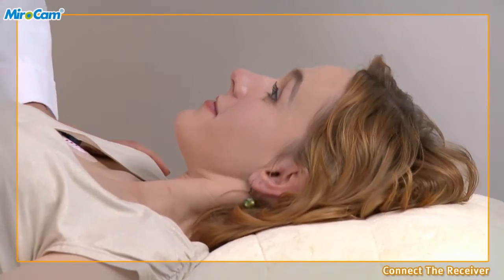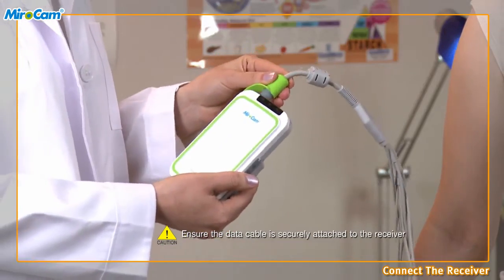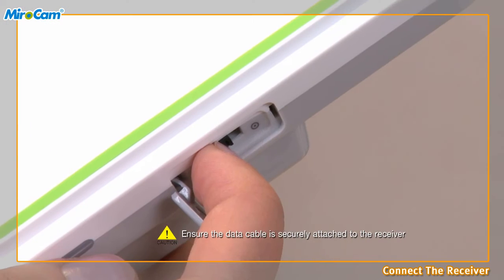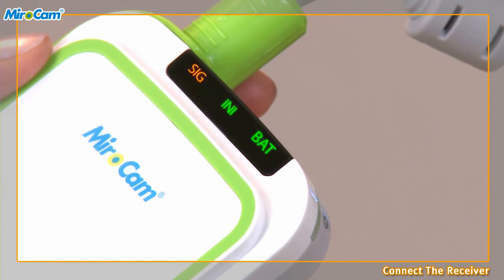Connect the receiver. After attaching the sensor pads, have the patient sit up and connect the data cables to the receiver. Turn on the receiver and check the battery indicator. The SIG indicator should be orange and the INI and BAT indicators on the receiver should be green. If the INI indicator is orange, the receiver needs to be initialized. If the BAT indicator is orange, the battery needs to be charged.